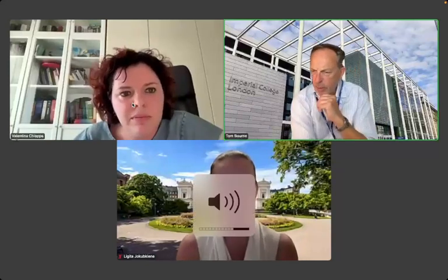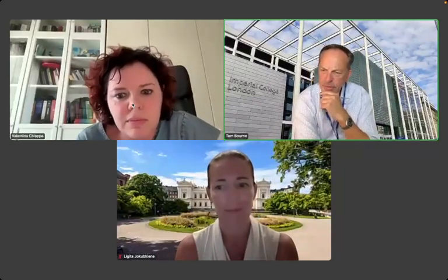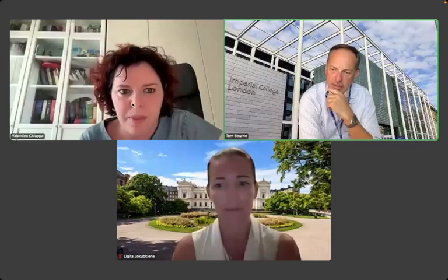Okay, just moving on. There's a straight question here about, do you prefer MV flow or power Doppler, or what's the difference, I guess? I mean, that's a loaded question on a Samsung webinar.